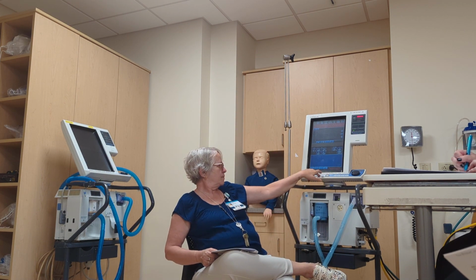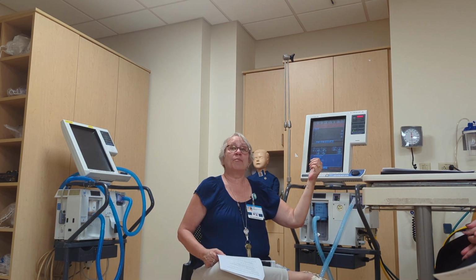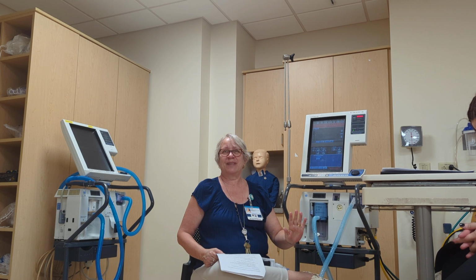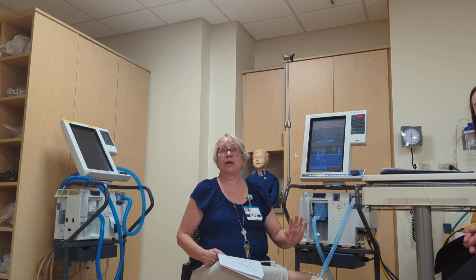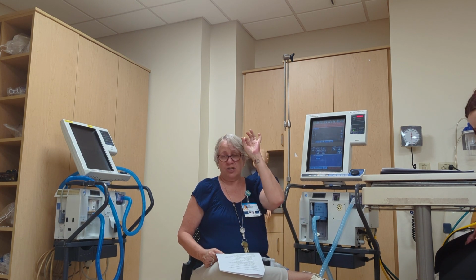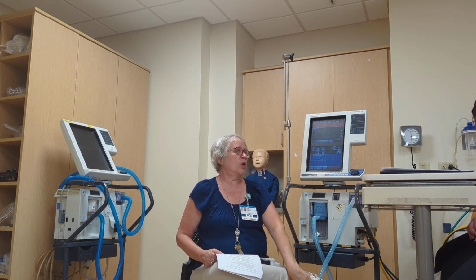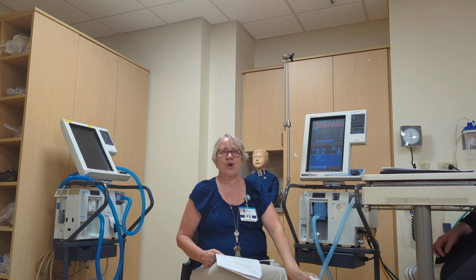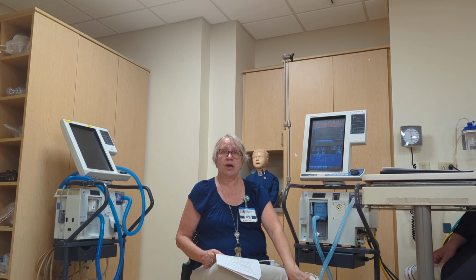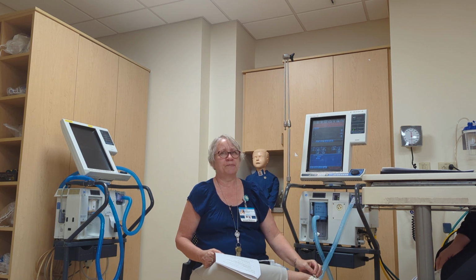So this is how you do it by hand, but most vents automatically calculate this. When I have run my SST, my ventilators have already done that. So doing this math, this is us doing the SST, not the vent. That is you doing that calculation. You won't ever have to do this clinically, ever, because your vents do it. But you will do it on your test and you will do it on your boards because they want you to understand the concept. Does that make sense?